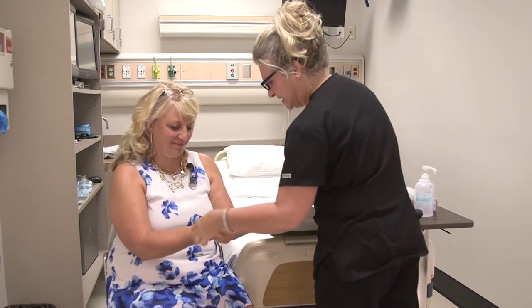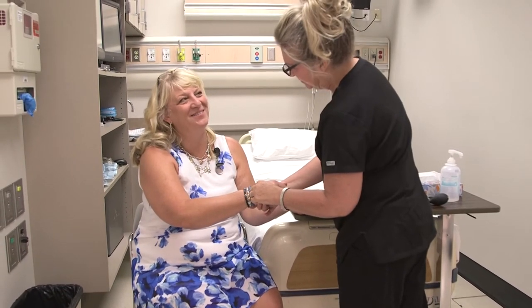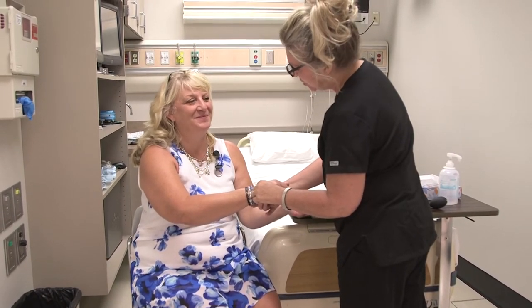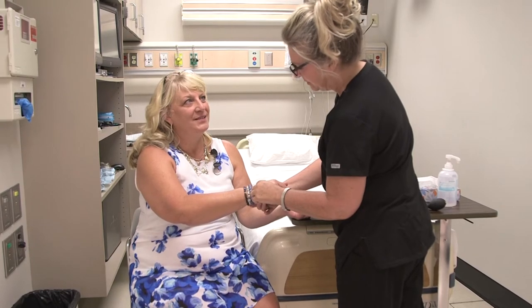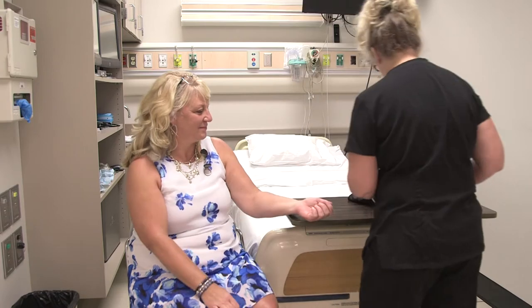I'm just going to check your wristband real quick to see if I got the right patient. Can I have your full name and date of birth, please? Sally Ernstmeyer, 3/7/66. Okay, let me just check my chart here.